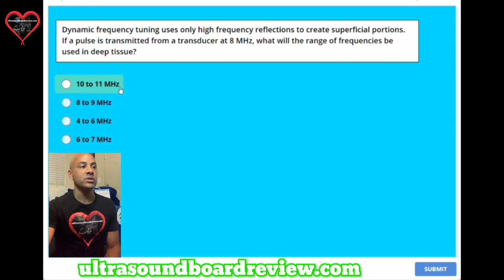A, 10 to 11 megahertz, B, 8 to 9 megahertz, C, 4 to 6 megahertz, or D, 6 to 7 megahertz. The answer is D, 6 to 7 megahertz.